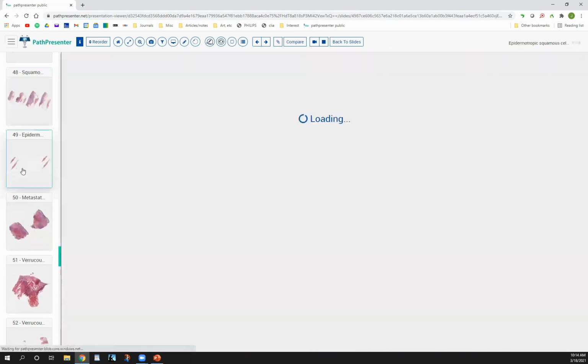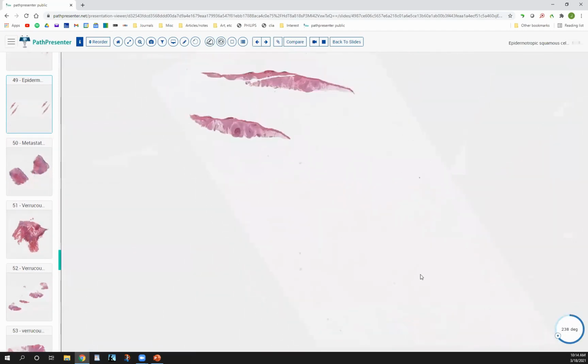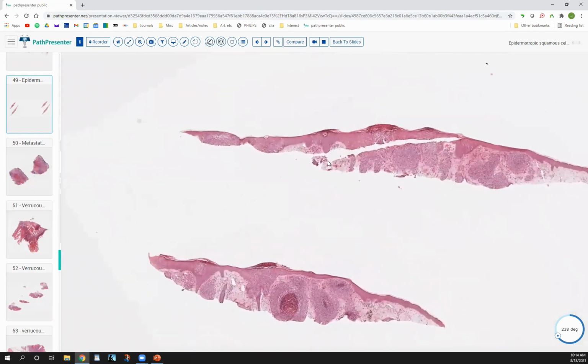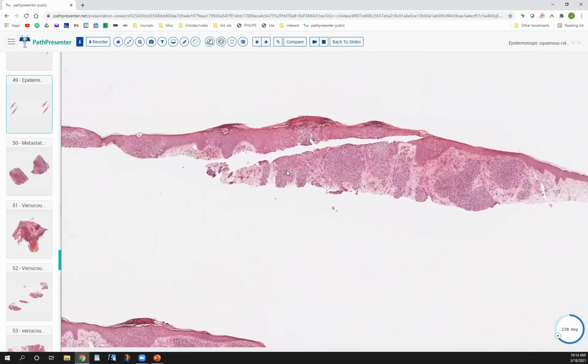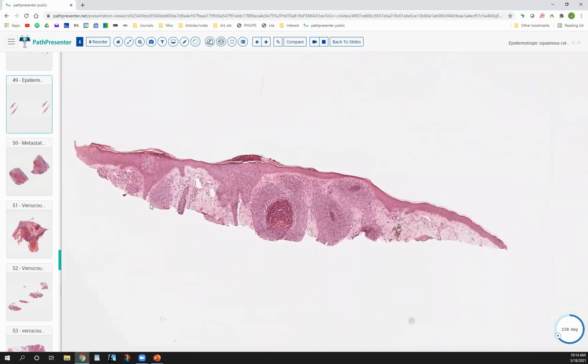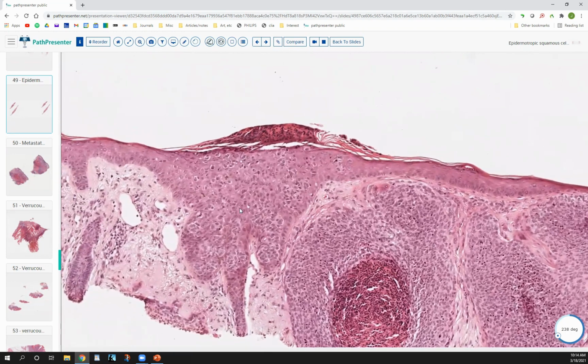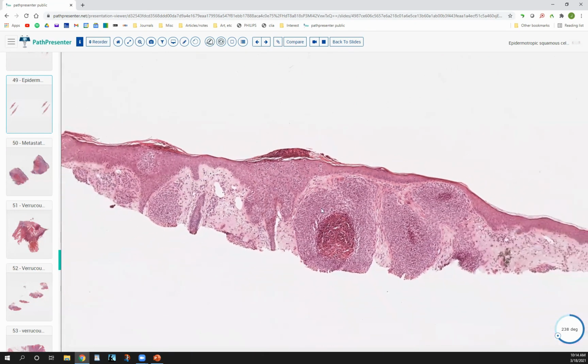Interesting case there. Here we have a squame that is actually invasive squame right here, arising in association with squamous cell carcinoma in situ. And the in situ component is showing a little bit of this pagetoid pattern. We have individual atypical cells imparting this upward scatter or pagetoid appearance with an invasive component right next door. So that's kind of another variant which you may come across.